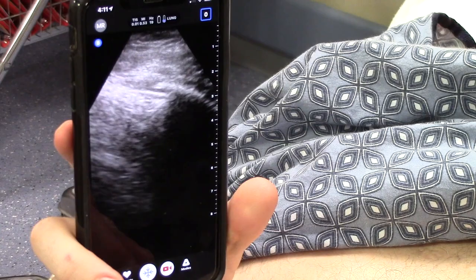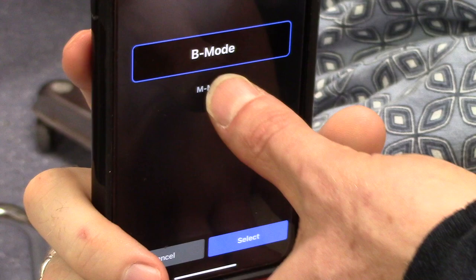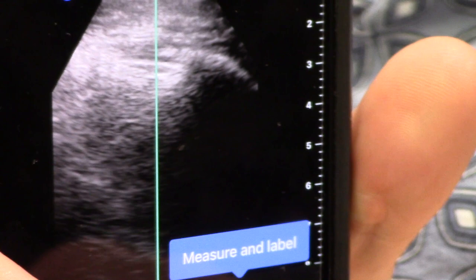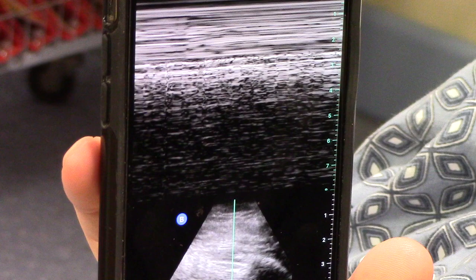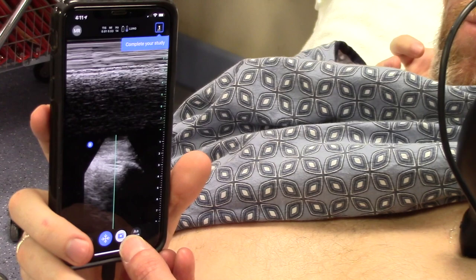You can switch this over to M-mode, which I like to do. So we go to M-mode, and I'm going to freeze that. And that's what we call the sand on the seashore. You can see clearly that these consistent horizontal lines are all of the tissues outside of the chest. And then when you hit the pleura and the lung, you get this absolutely different looking appearance. So sand on the seashore, waves coming into the seashore — either way is fine. But that is clearly and easily identified, and something I always do to help me feel more comfortable that the lung sliding I'm seeing is exactly what I'm seeing.